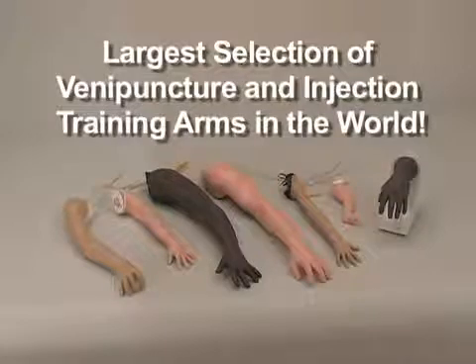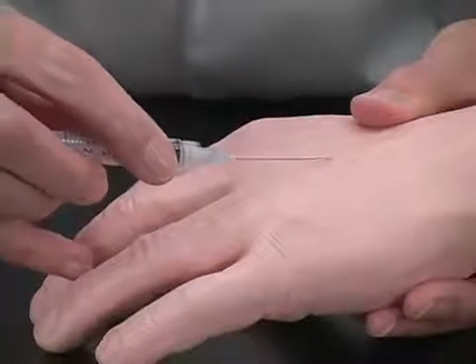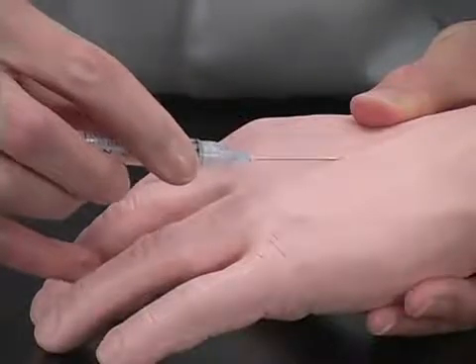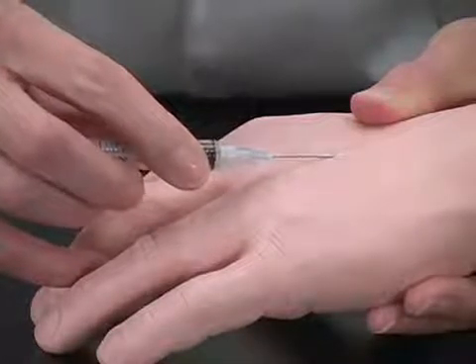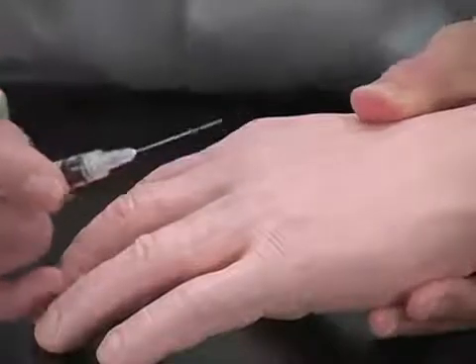All of the NASCO arms contain our unique lifeform skin and vein system. The lifeform skin has extraordinary detail and unmatched realism. It is tough, like human skin, presenting the realistic feeling of breaking through the outer skin layer. Our lifeform veins give the accurate pop sensation of correctly entering the vein. The lifeform skin and vein system is manufactured from self-healing materials, which prevents leaking after multiple uses and keeps the outer skin looking new.